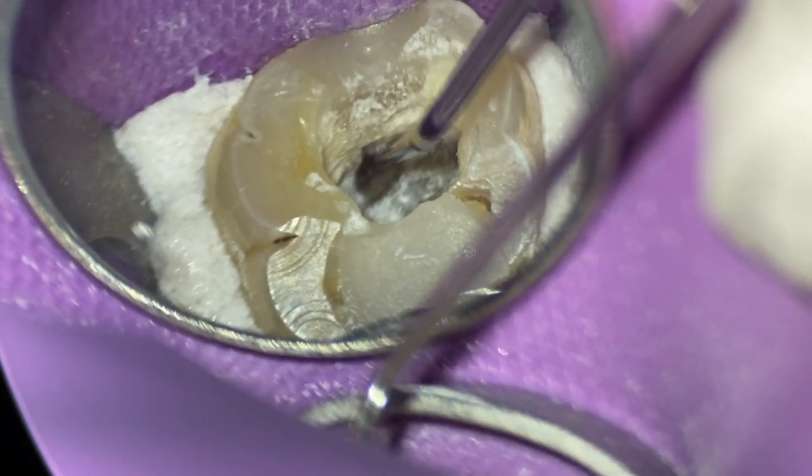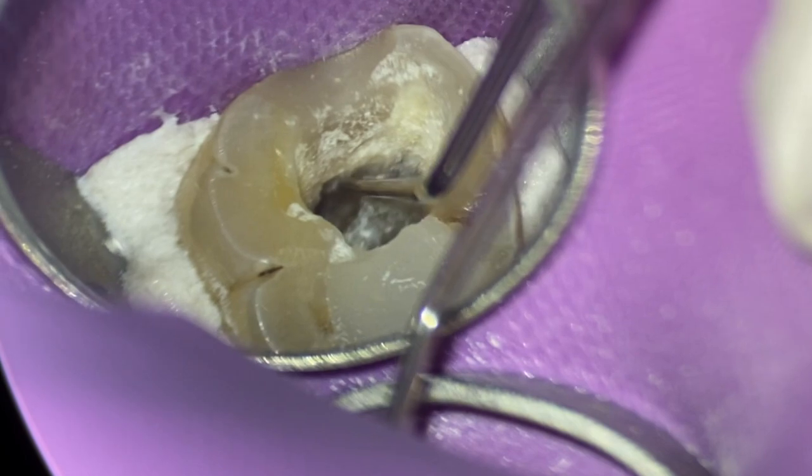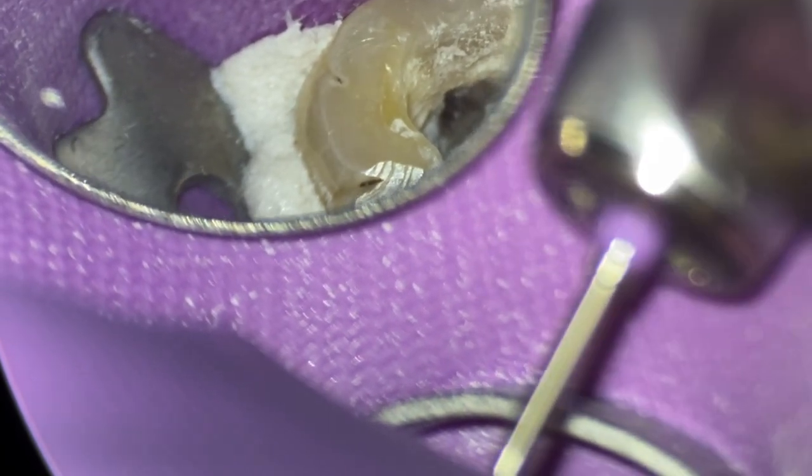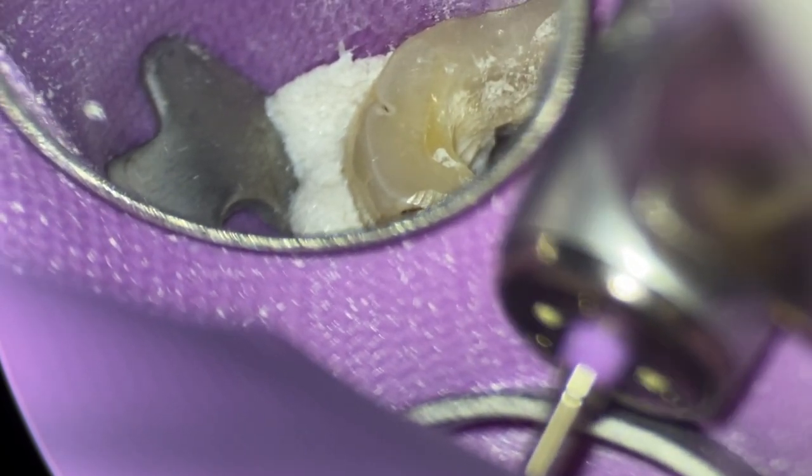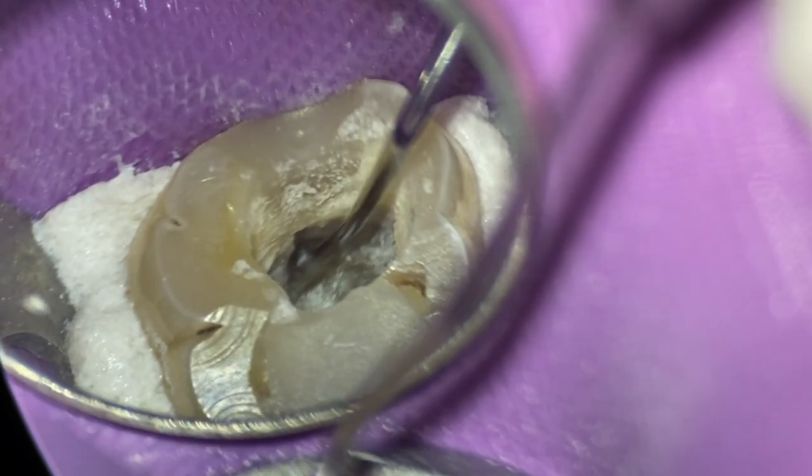So I know that I've got some wiggle room to tackle this. I see two white dots. In the back of my mind, I'm kind of like, let's see if I should be using an endo explorer, maybe. So grab my endo explorer. I'll put pressure on one and then it kind of disappears. Let me know in the comments below if you know exactly what I'm talking about, when you put pressure on one of these white dots in root material and it disappears.